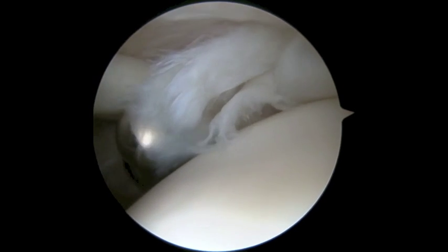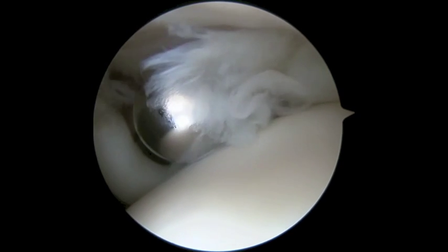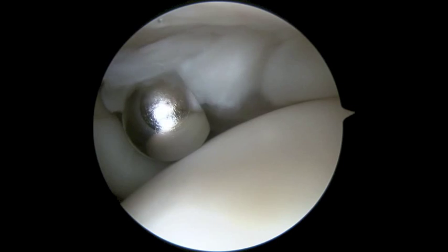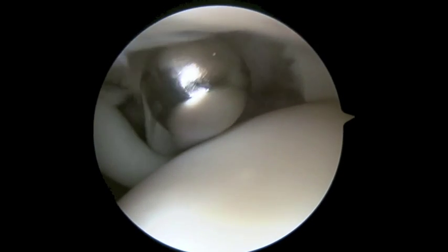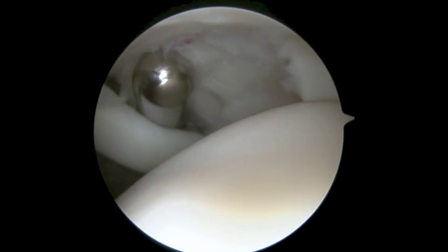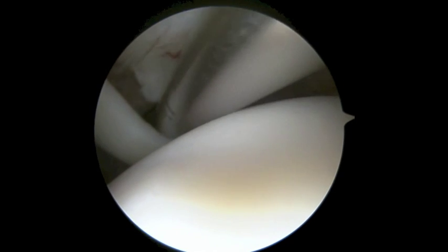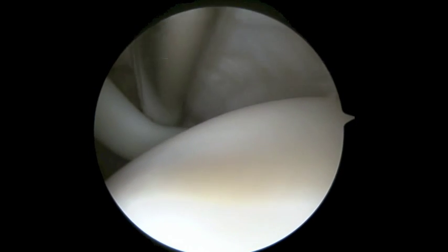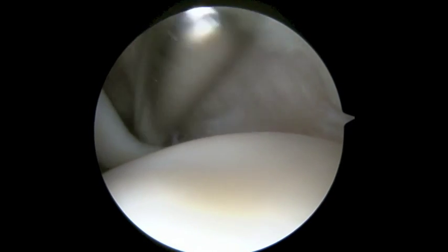Okay, so here we're looking at a patient who has a partial rotator cuff tear, and you can see those torn fragments that are catching inside his joint. And that's a shaver that we put in that has a suction, and we're able to debride out, meaning remove and get rid of those fragments that are catching inside the shoulder and causing pain. And we remove all those torn fragments back to a smooth, stable border that doesn't leave any edges that can catch and cause pain in the patient.